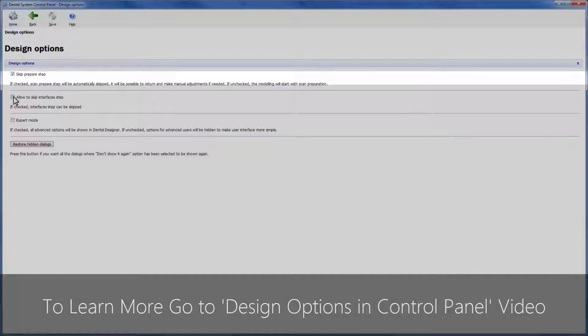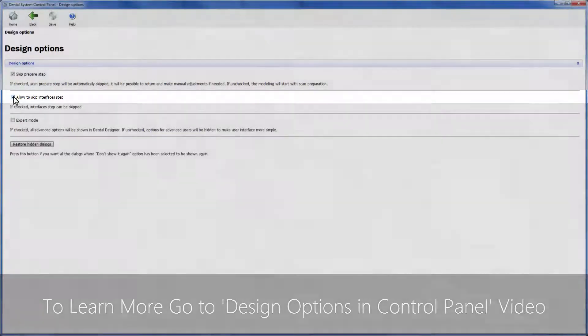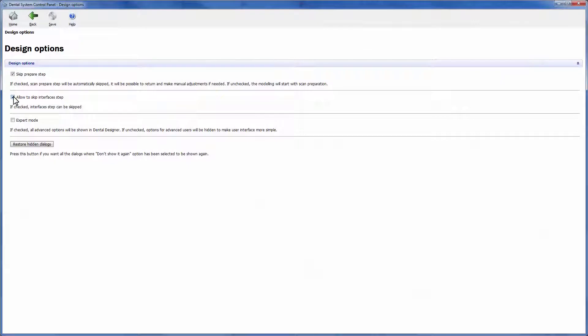Optionally, you can do the same to skip the interfaces step later on. Drill compensation and cement gap will still be applied automatically.